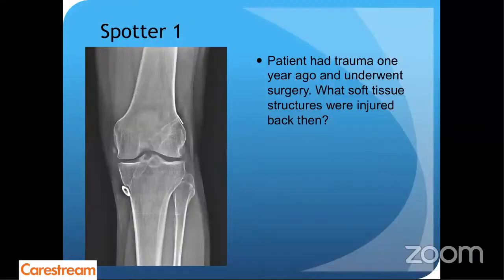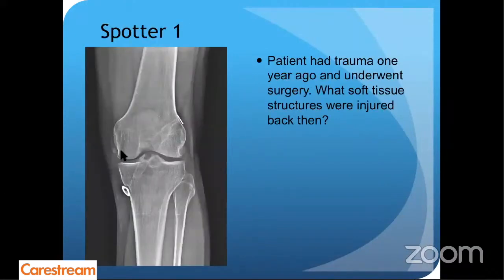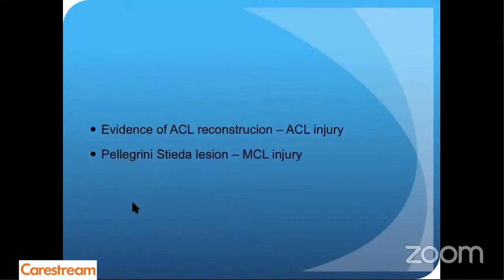Time for some spotters. What soft tissue structures were injured previously? There are two soft tissue structures. So there is obviously evidence of ACL reconstruction, so there was an ACL injury. And if you see here, there are Pellegrini-Stieda lesion calcifications, so obviously there was an MCL injury as well in the past.